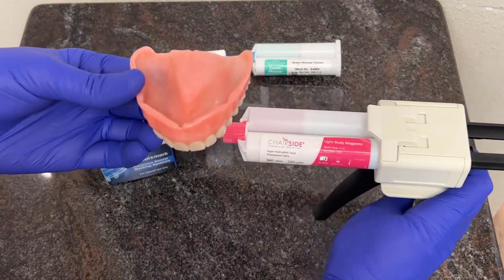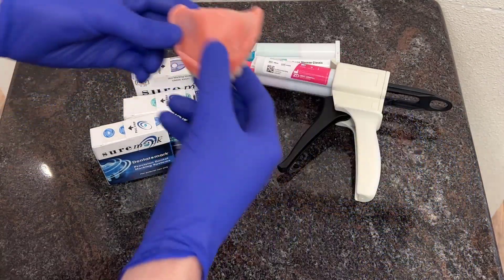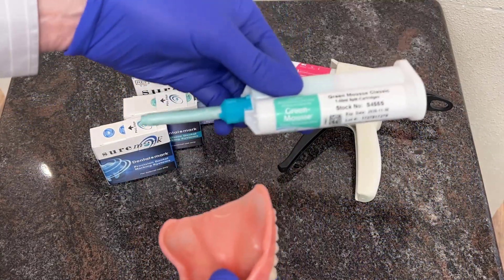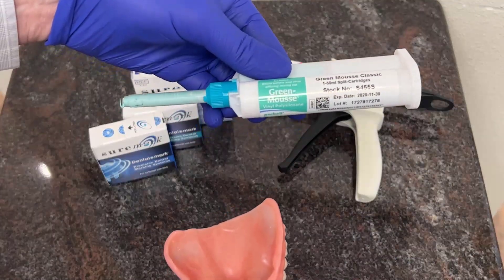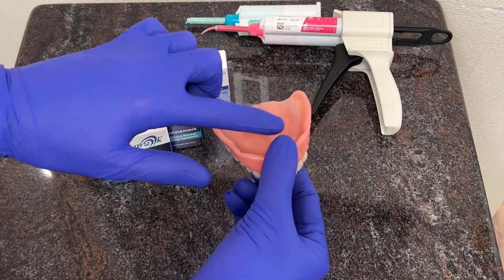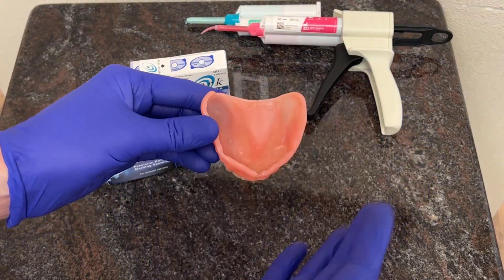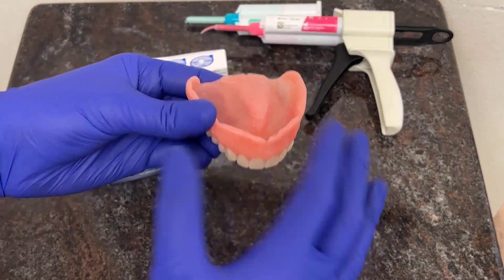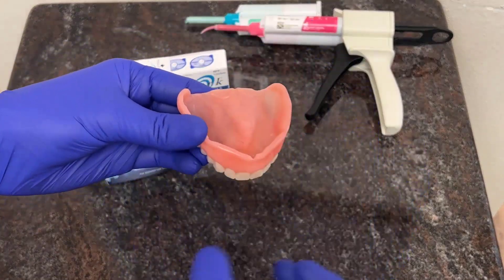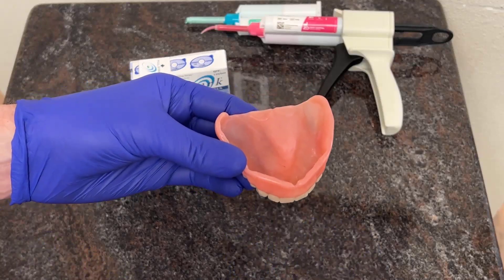You can use a PVS impression material, like from Zest Dental Solutions, or a radiographic PVS impression material called Green Mousse. Both of those would work on the inside of the patient's denture. Most importantly, whenever we're placing PVS on the inside of the denture, you put it back in the mouth so that the patient has border-molded it at the correct vertical dimension with what's called a closed-mouth reline impression.